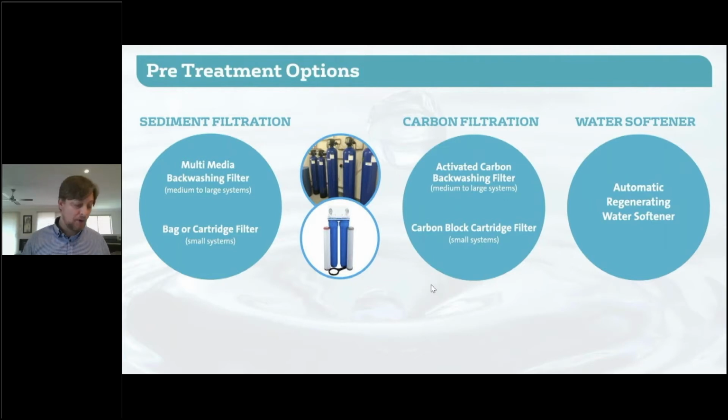Because we're treating potable water, it's chlorinated from the council, and often in a hospital scenario, the hospital will actually top up that chlorine level to ensure the disinfection of the water throughout the site. And it is important that we remove that chlorine before the RO to look after the RO system.